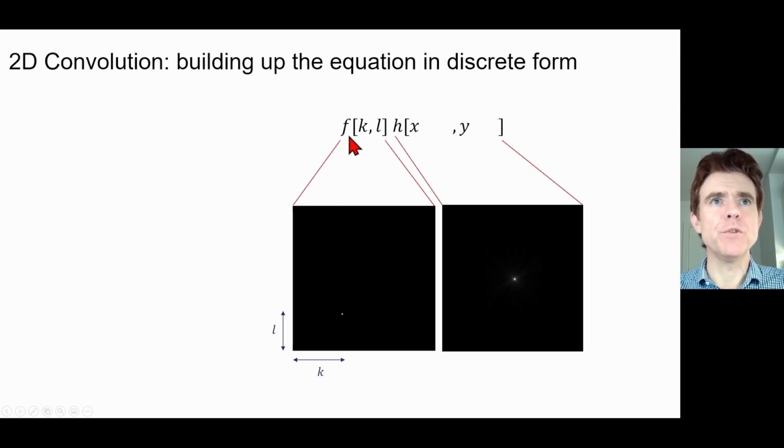So let's say then we've got some radioactive concentration F at discrete positions k and l inside a 2D array. So I've got this k value along in this, if you like, X direction, and this l value in the Y direction. These are just integer indices of the pixels in this 2D array, in this 2D image. So that's the true distribution, just represented as a discrete function.